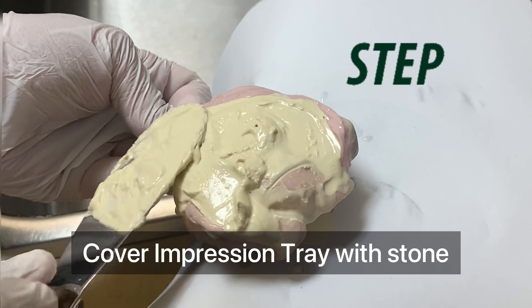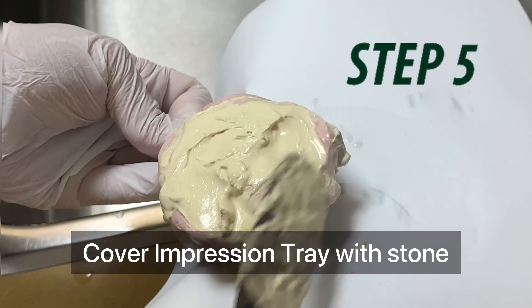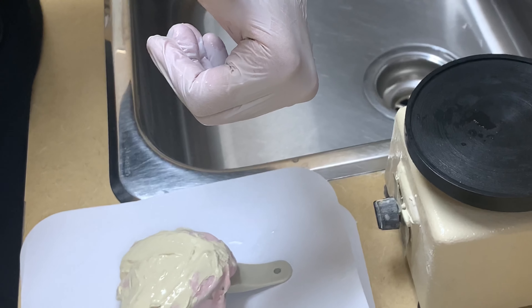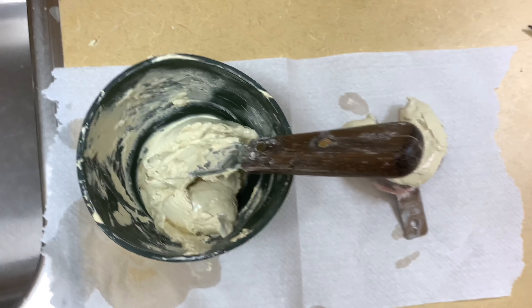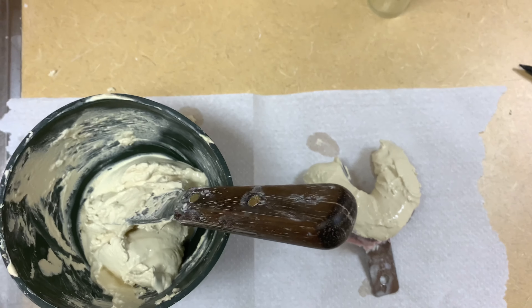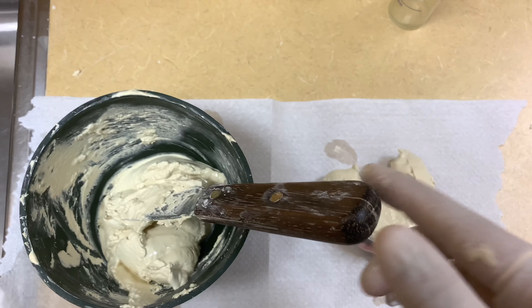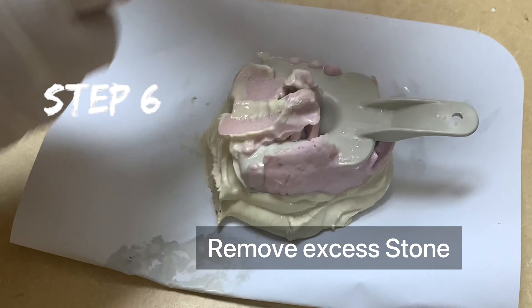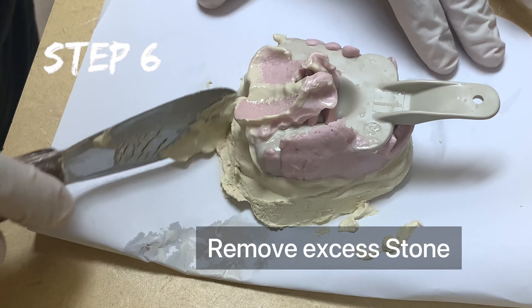Remove the tray from the vibrator and place a large amount of stone to cover the whole area of the impression, ensuring there are no voids. Use the same technique for both maxillary and mandibular impressions. Place the remaining dental stone onto the dental slab and invert the impression tray onto the base.